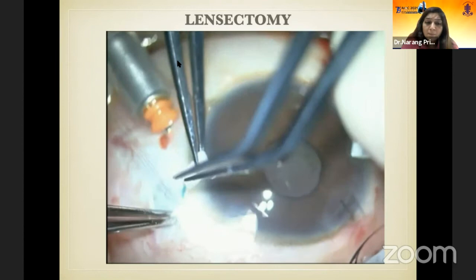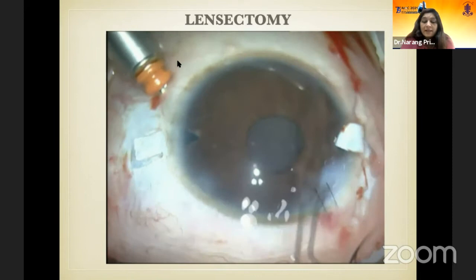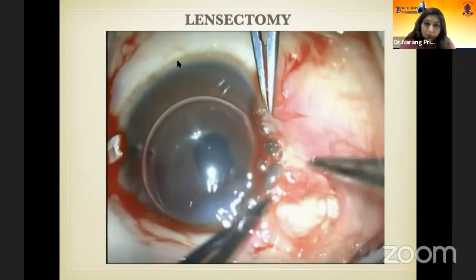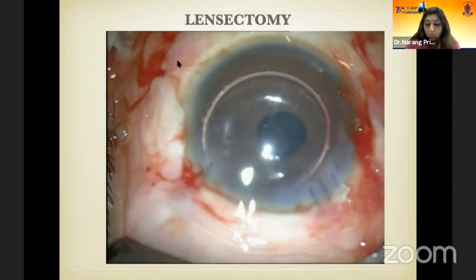Although it's not as simple as it looks in the video, it has its own challenges, but that comes with the experience of a surgeon. For fluid infusion, you can use an anterior chamber maintainer also. It's not necessary to use a trocar infusion. You can use that, and you can do it when you are putting up the glue. You need to dry up the entire surface area. There should be no fluid coming, otherwise it washes off whatever amount of glue that you are putting into it.